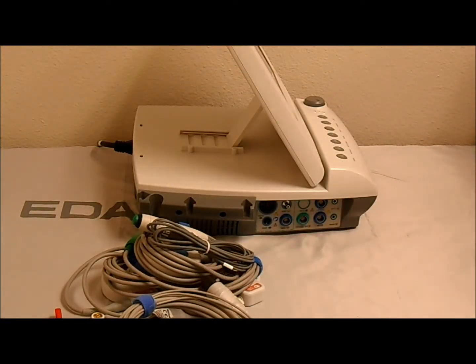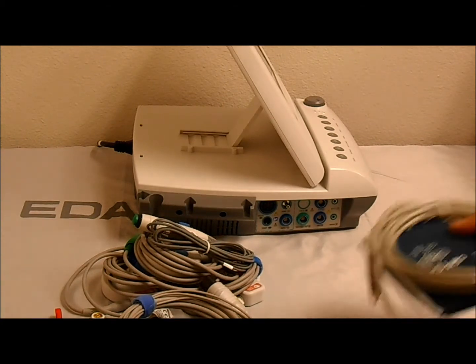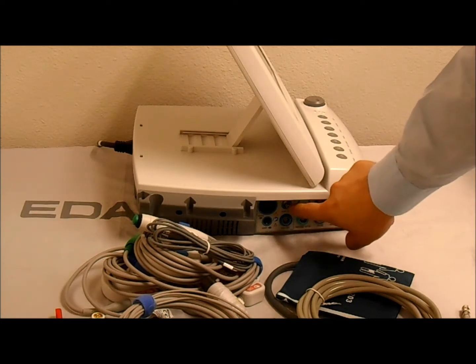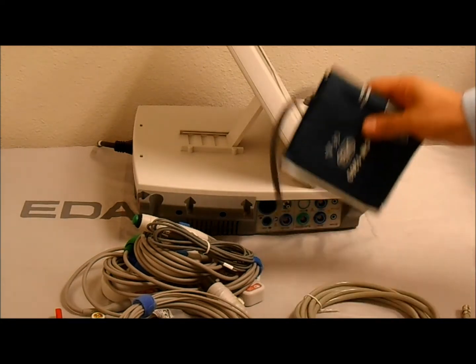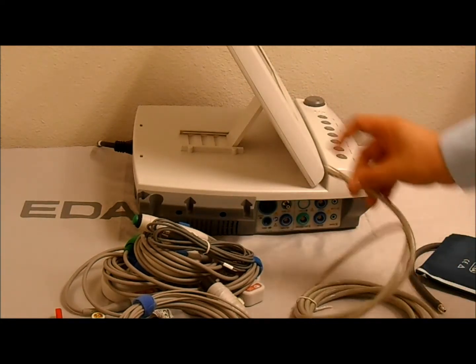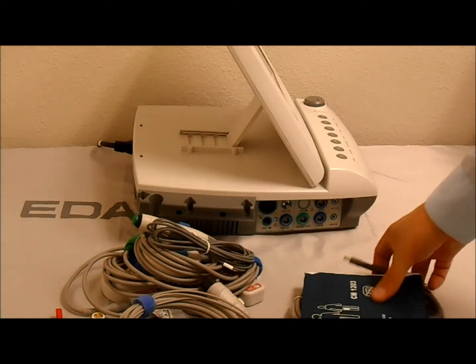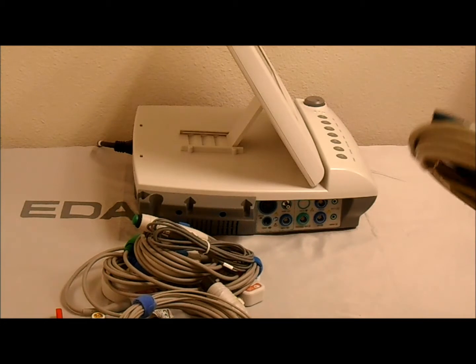And next, we have the NIBP pieces, which is your tube and your cuff. So the tube connects to the NIBP tube port on the monitor, and the cuff connects on the opposite side of the tube. And this is how you can take an NIBP reading on your patient and get the reading on your monitor.